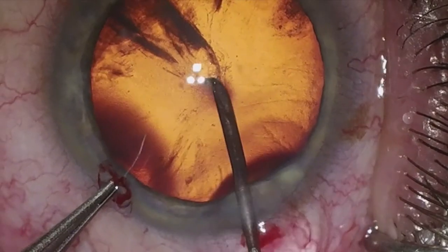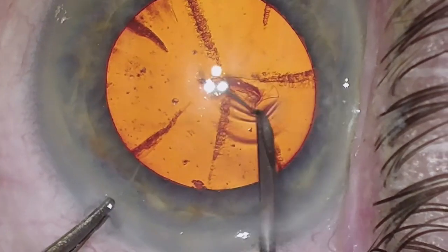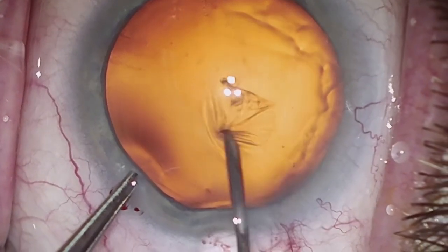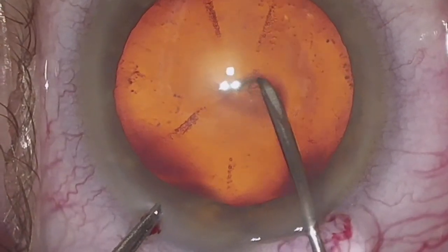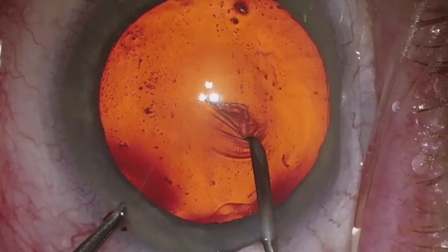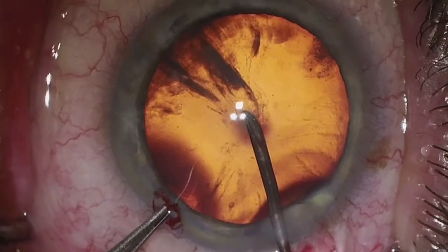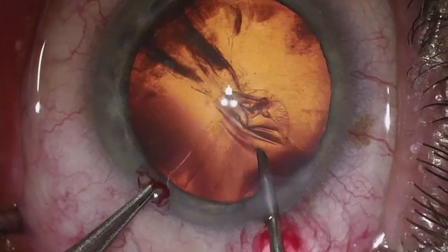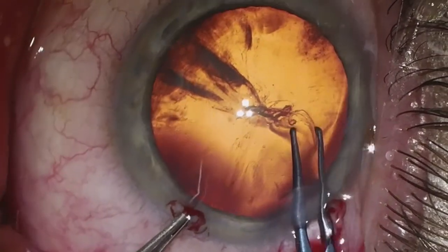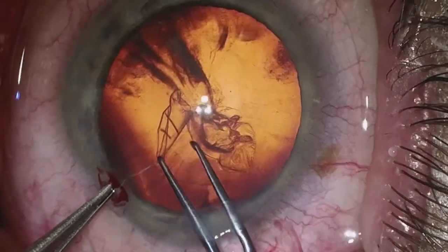Once again, another example — one continuous motion. We create a leaflet there that we can readily grab with the Utrata forceps and reflect to complete a continuous curvilinear capsulorexis. I want to show you once more just how easy it is to grab that leaflet with the Utrata forceps. Using the same technique, we grab the leaflet here with the Utrata forceps.